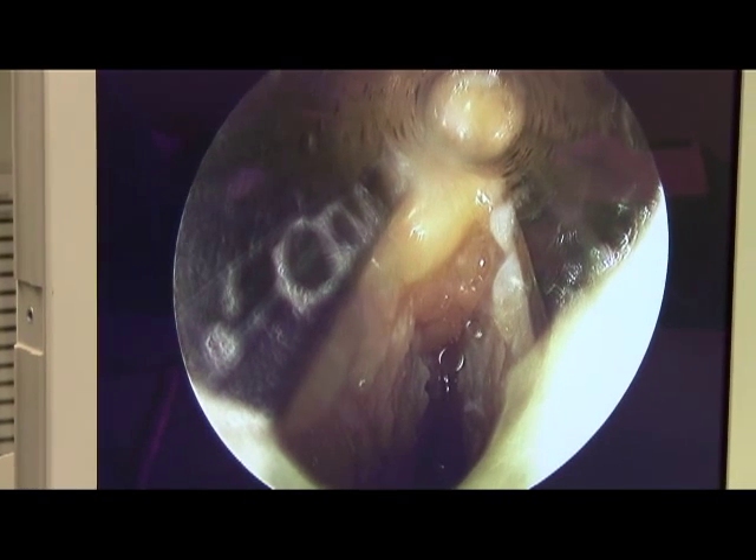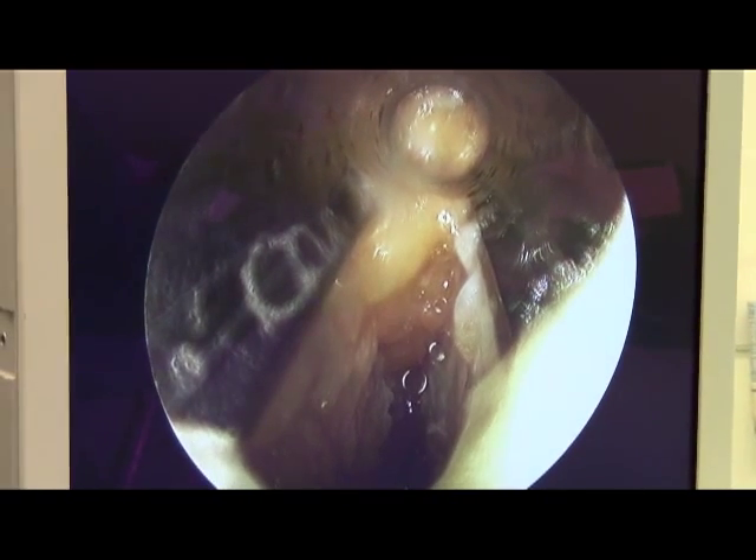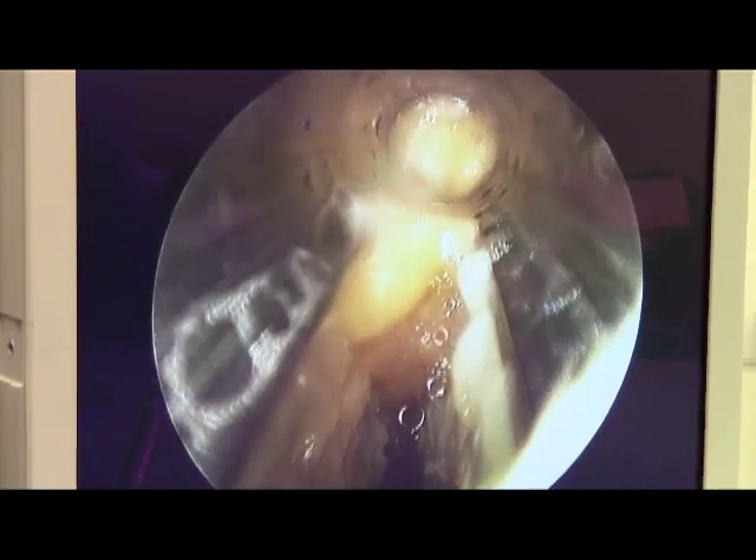So the plantar fascia has been transected — the medial band of the plantar fascia has been transected — and that's really the extent of the procedure. The procedure has been completed.